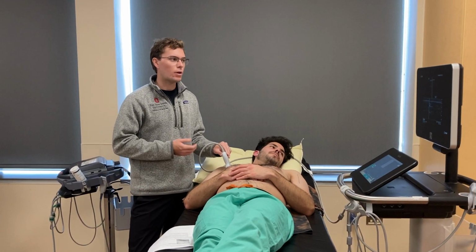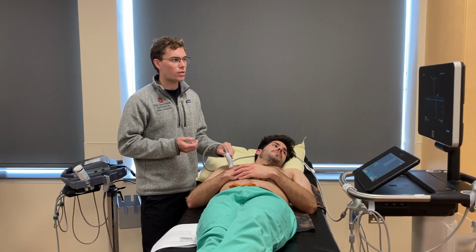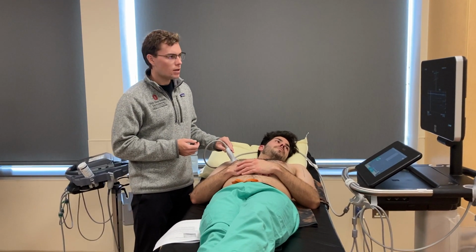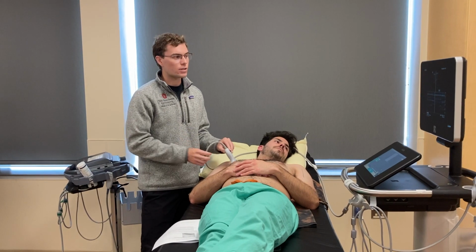Management-wise, if they have a pneumothorax, you're going to proceed to needle decompression or a chest tube. Other pathologies you can find with the ultrasound are pleural effusion, which you can tap, and then use Light's criteria to further diagnose it.